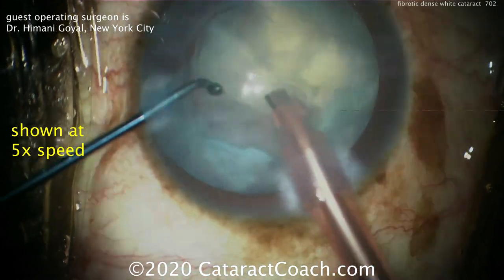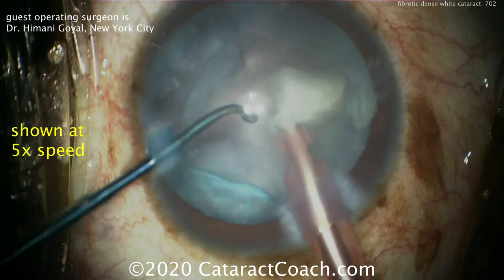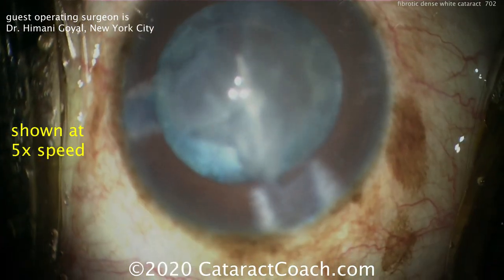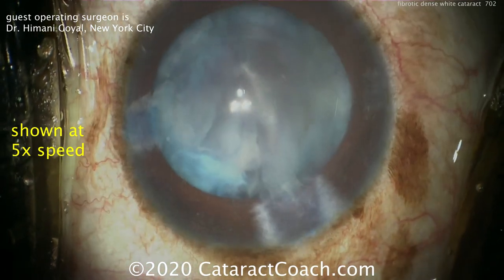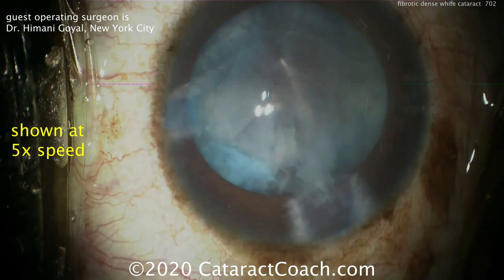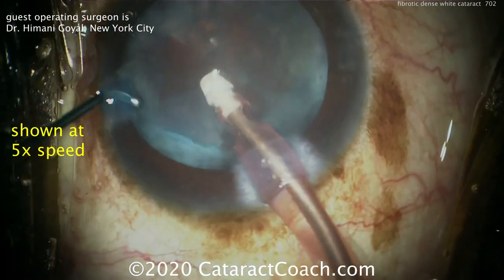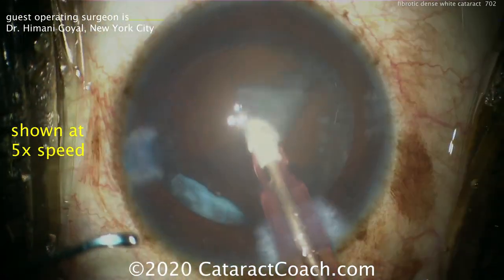The remaining pieces can be brought up and chopped — the stop and chop technique, which is very effective and goes well. Now it looks like there's some epinuclear shell; the nucleus has been removed. We now need to remove the remainder of this material, so going in with the IA probe to aspirate it. The chopper is ready in the second hand to help push any pieces down the port.